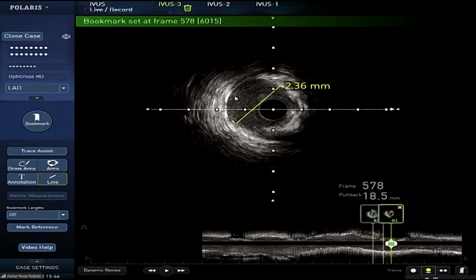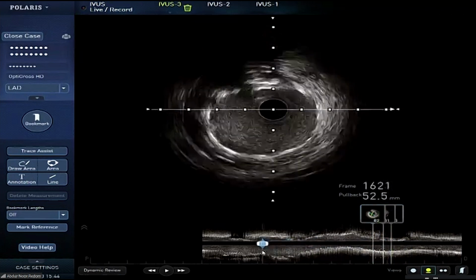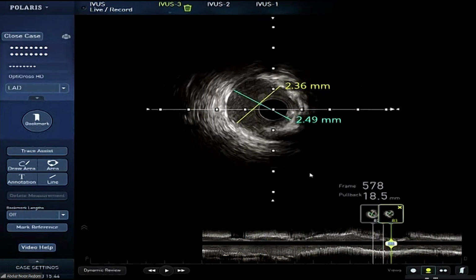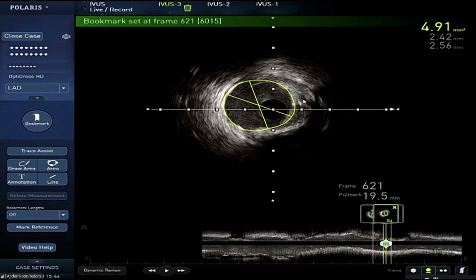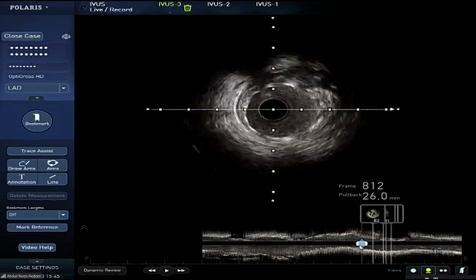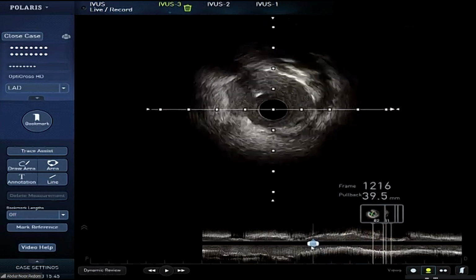Here for the younger colleagues, if I went with this 4 to the distal, then there would be catastrophe. So it is 2.4. So 80% expansion is there. Yeah, so I think the two most important things are minimal stent area, the stent expansion, and lastly, apposition. If you give me these three, that's the order of importance. So minimal stent area more than 5 as shown by the ULTIMATE study, and stent expansion anything more than 65% is good, and malapposition, I think that's where we don't have any good data.